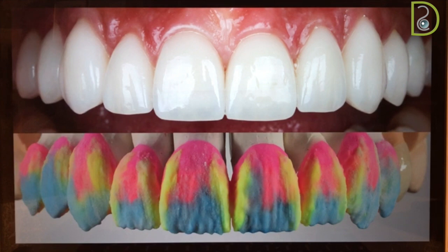and choose the light for your first central incisor, like tooth number 1-1. Then use the light plus for tooth number 2-1. Then you'll be able to make a decision and choose which one you're going to go for.